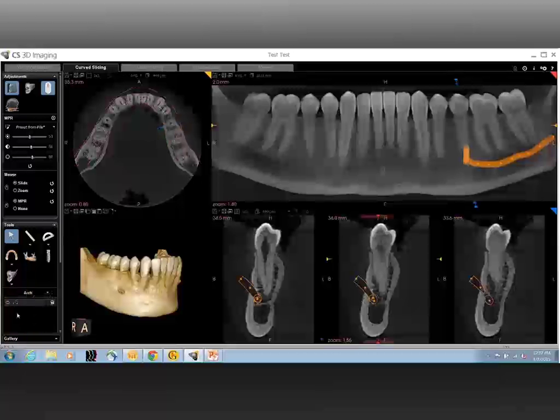So from what I'm getting, the clinician should note not just the pathological findings. They need to input these into a chart to record that the scan was actually evaluated. And if they're finding something in the scan that they're not confident of a diagnosis, they should look to an expert for those. Dr. Katal, I do have one more question for you. I often get asked the question when dealing with a clinician who may not have a cone beam in-house. They ask me, do I have to scan the mandible if the panoramic view, the panoramic 2D radiograph, shows all the anatomy that is needed for implants? How would you comment?